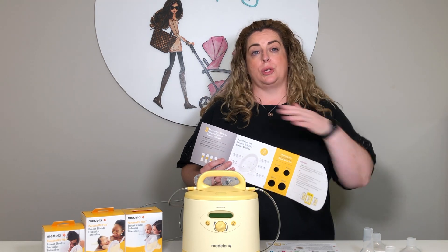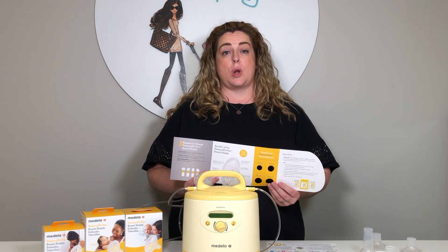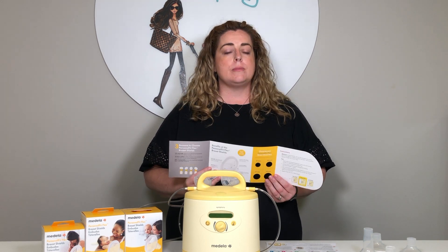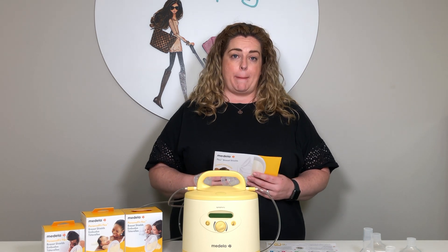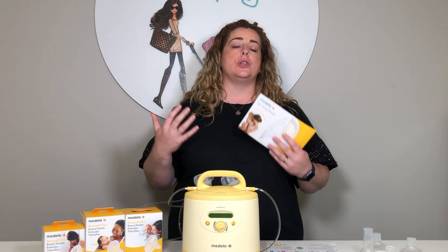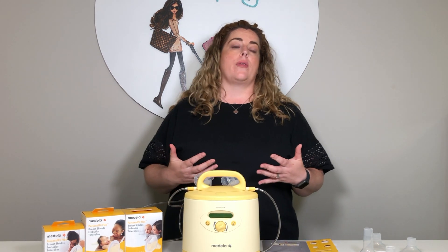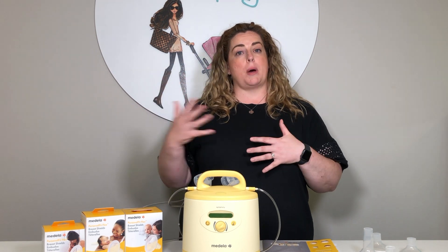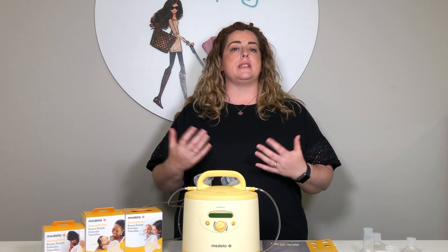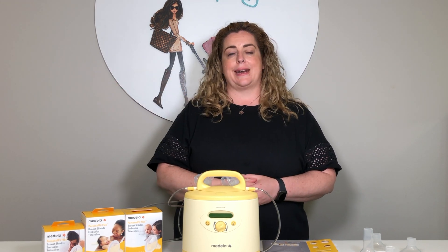Some people will have to go through using the various sizes until they find the perfect fit. Unfortunately, once you purchase, open, and use any of these breast shields, they cannot be returned for hygiene reasons. It's also worth noting that if you're pumping longer term, your nipples can change and grow in size. You might start out just fine with the 24 that came in your package, but as your pumping journey progresses and your milk supply increases, you may find your nipples also grow and need to increase your shield size at a later stage.